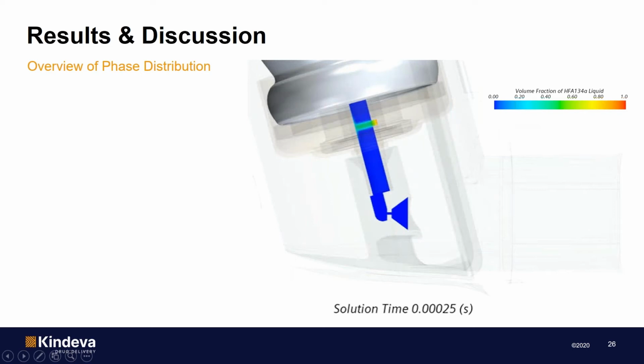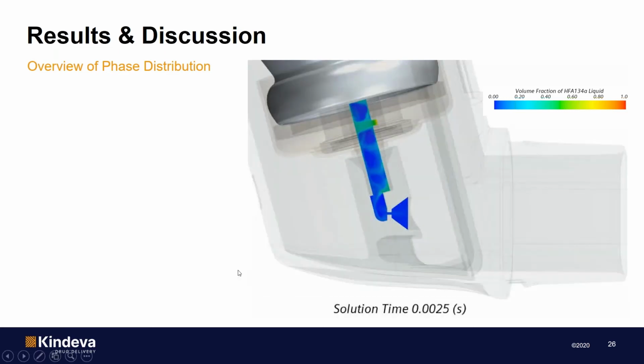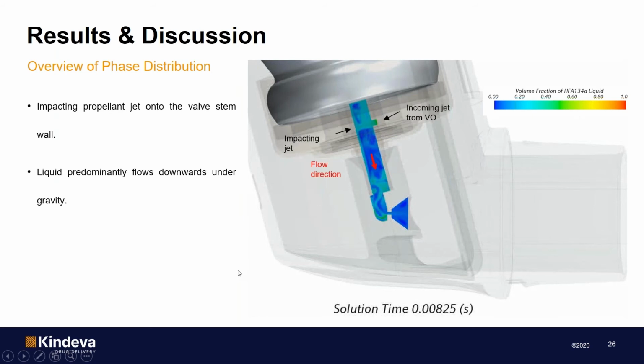So first we show an animation with an overview of the predictions of the CFD model, and we are going to look at the distribution of the volume fraction of liquid. So the color scale corresponds to phase volume fraction. So if I just run this animation, we can see that straight after coming in from the metering chamber, a propellant jet is predicted to impact on the valve stem wall opposite the valve orifice.